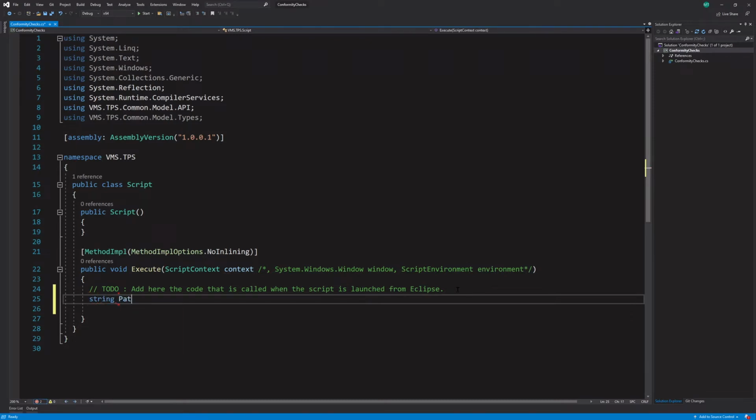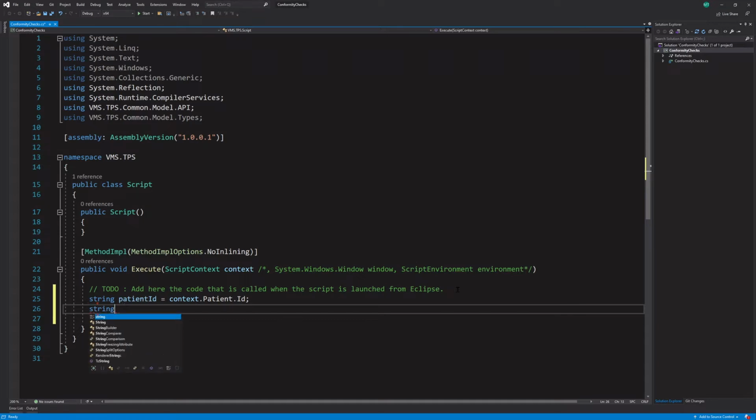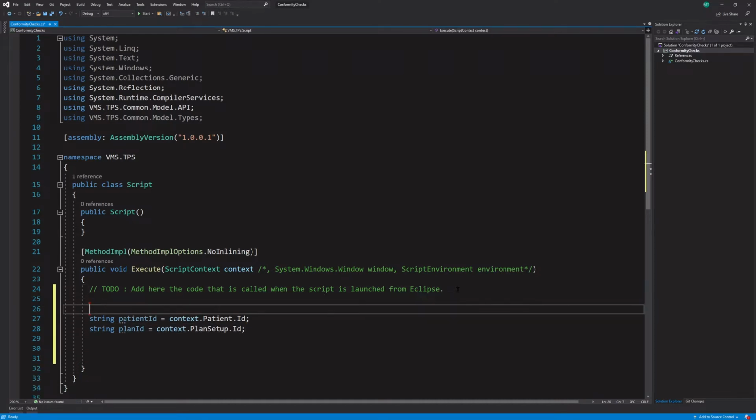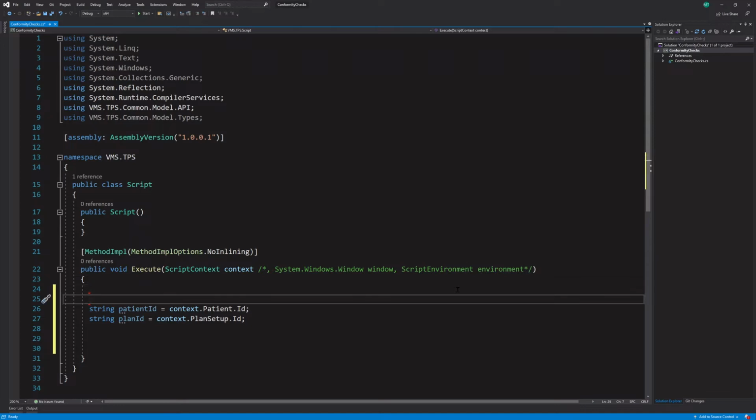So let's say string, let's call it patient ID equals context dot patient dot ID. And then let's do string plan ID equals context dot plan setup ID. And first, let's do some checks. So I'm going to get rid of that. And let's add some comments too.